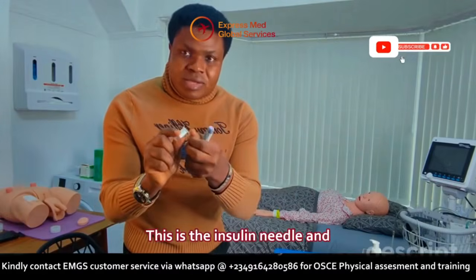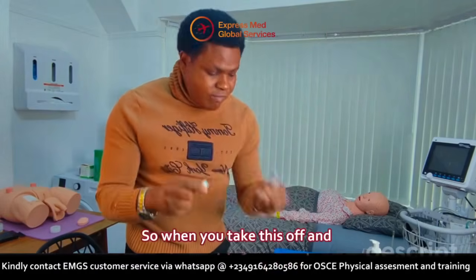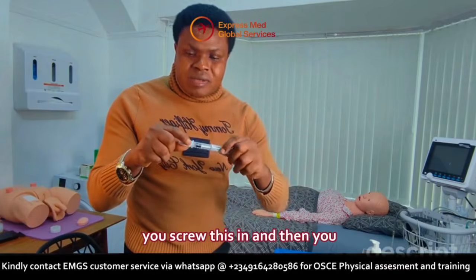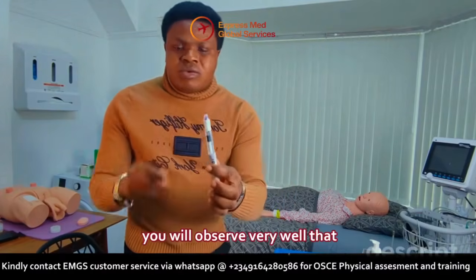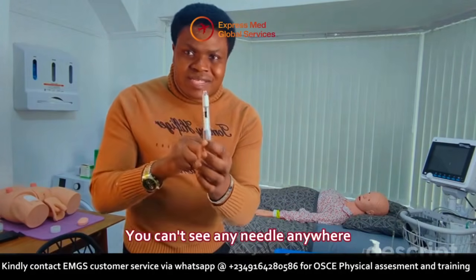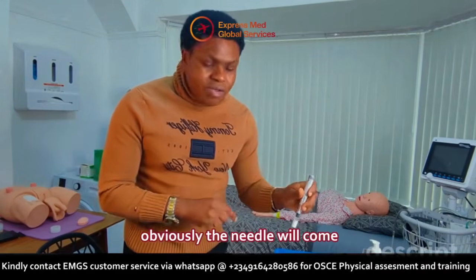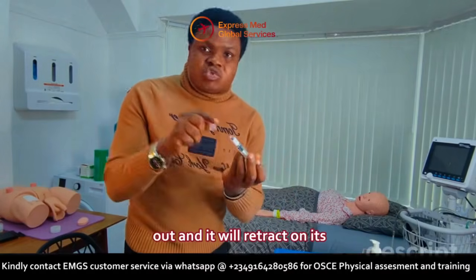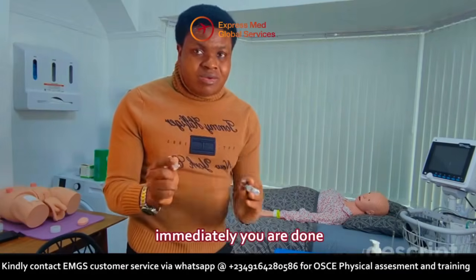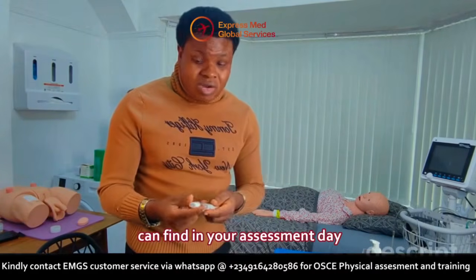This is the insulin needle and the expiry date will be somewhere here. When you take this off and then you screw this in, observe, you screw this in and then you take the cap off, you will observe very well that you cannot see any needle anywhere. But by the time you are administering to the patient, obviously the needle will come out and it will retract on its own and activate its own safety lock immediately you are done. So this is very, very advanced. You don't know which needle you can find in your assessment day.